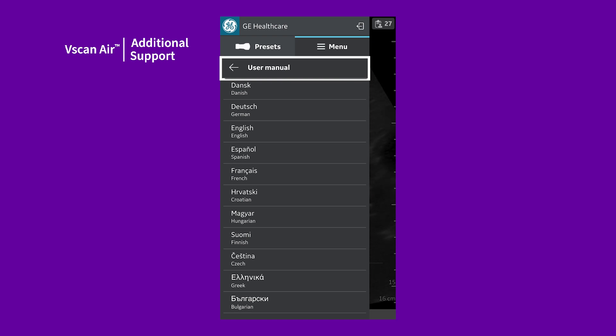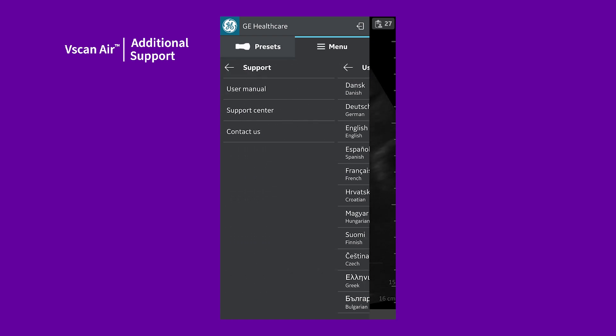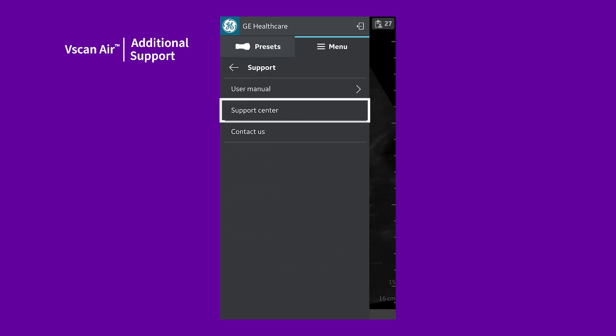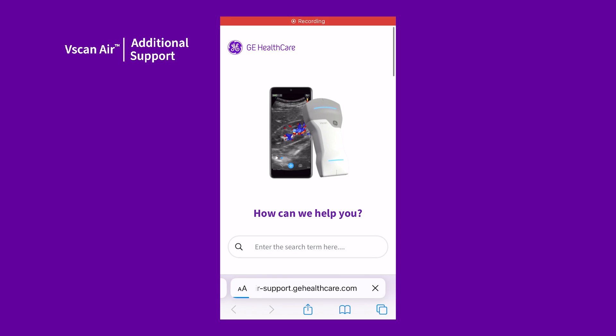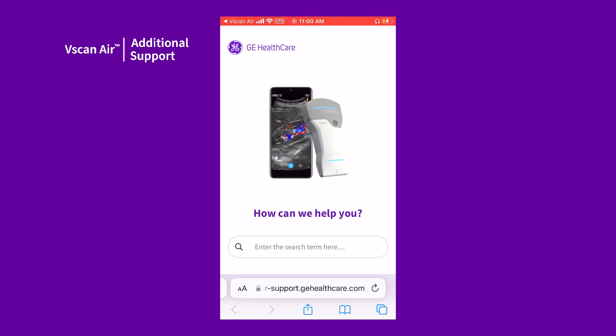For further assistance, return to the Support menu and tap Support Center. This will connect you to GE Healthcare Support website that hosts tutorials and educational materials. An Internet connection is required to access these reference materials online.